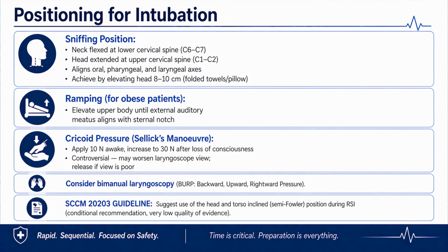More importantly, if we are giving too much pressure during this Sellick's maneuver, that may impair the glottic view. So it is not a mandatory part of RSI nowadays. I would suggest if the patient has high chances of aspiration or is a full stomach patient, you can do Sellick's maneuver. But if you see that it is hampering the laryngoscopic view or glottic view, then you release it immediately.